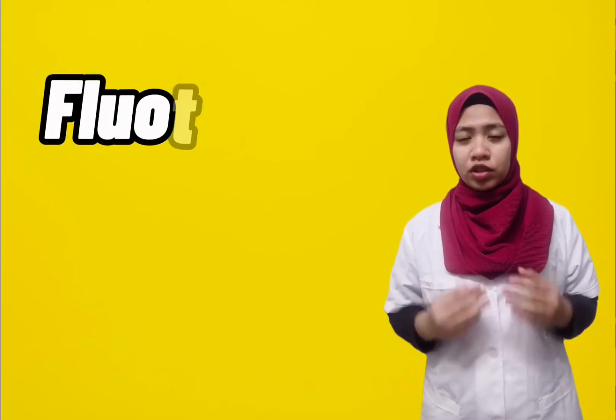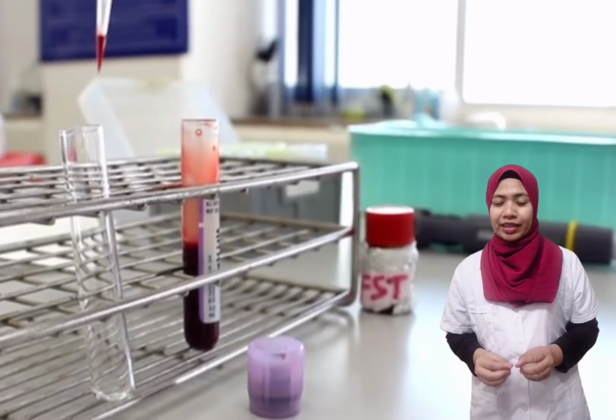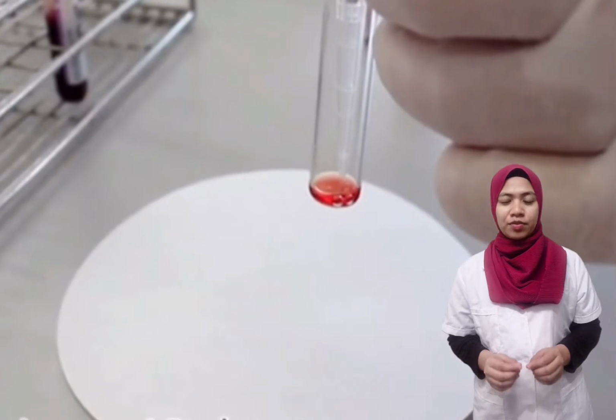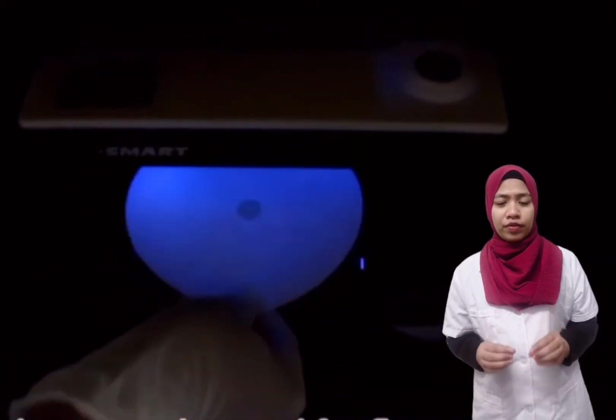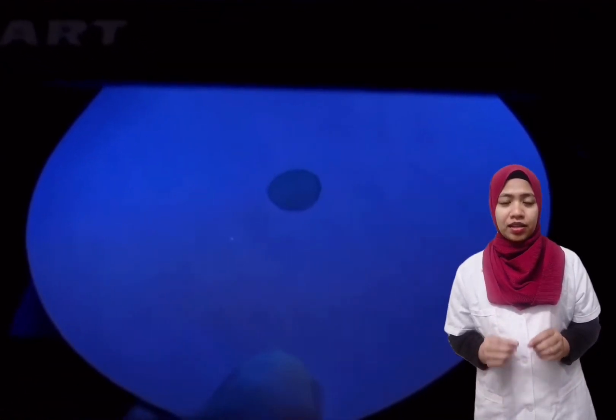The FST, or fluorescent spot test, for G6PD deficiency involves this reaction. To perform the test, a small amount of blood is incubated with glucose 6-phosphate and NADP in the substrate reagent and then spotted on filter paper. Once dry, the spots are viewed under a long-wave ultraviolet, or UV, light. The product of the reaction, NADPH, is fluorescent. NADPH fluorescence is directly proportional to G6PD activity, and lack of fluorescence signals G6PD deficiency.